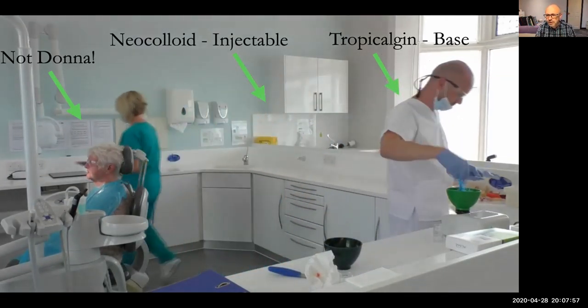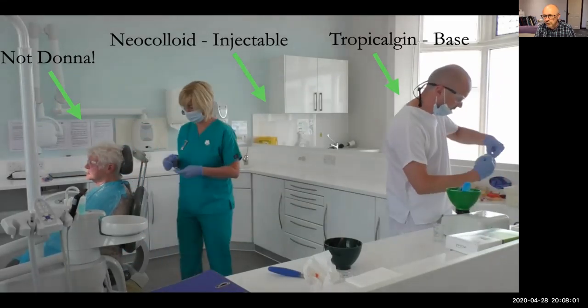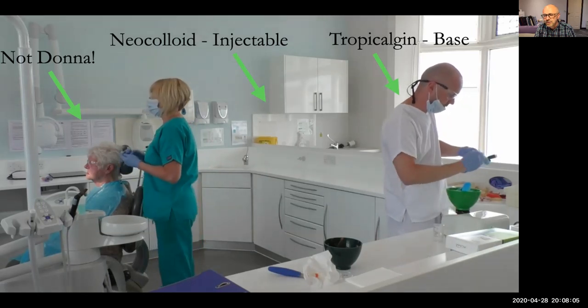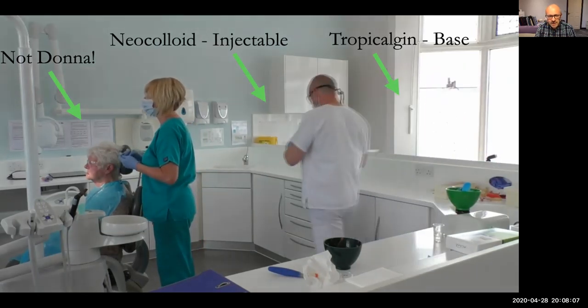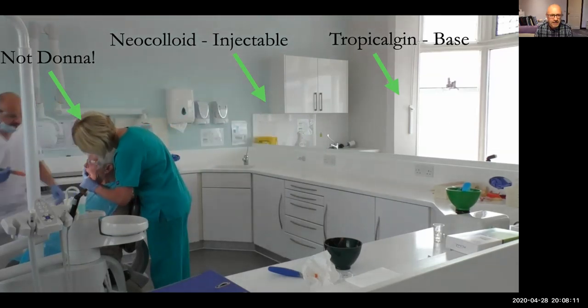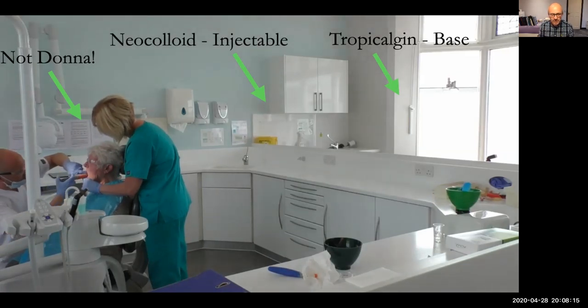And what I do now is I run water just onto the top of that and shape it up. I'm glazing it, and then we pop over to the mouth, to the patient, and Claire pulls the lip forward, and then I can get in there like this.